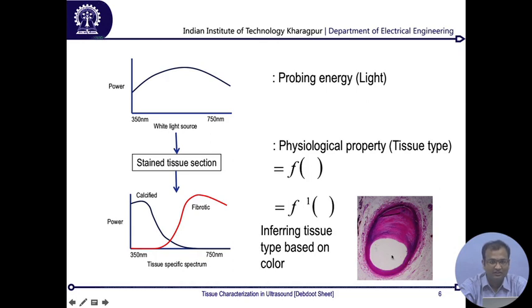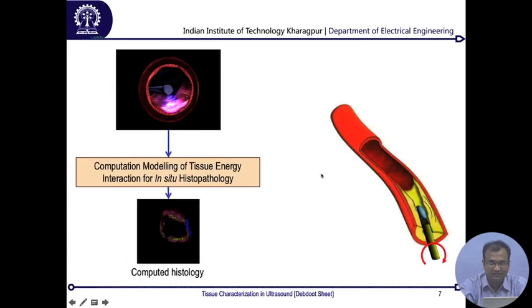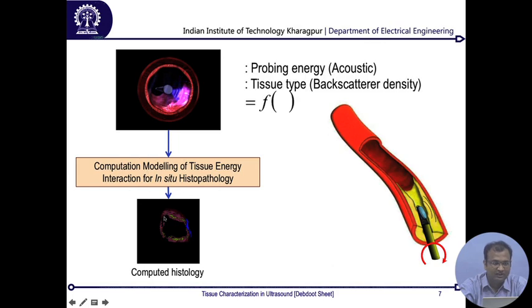Now if we translate this directly onto our ultrasound space, say I have this scanning ultrasound probe which circularly rotates, sends a pulse, and receives back the pulse. So I have a series of signals coming in, and on that stack of signals I need to apply some sort of mathematical model which will give me a map showing the relative density of these different tissues in different colors.